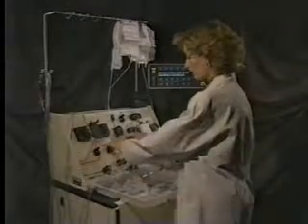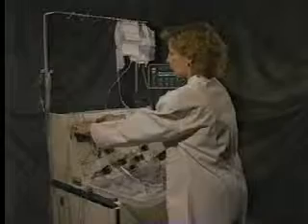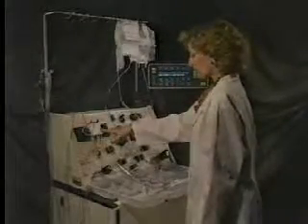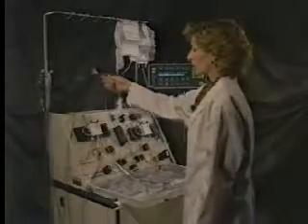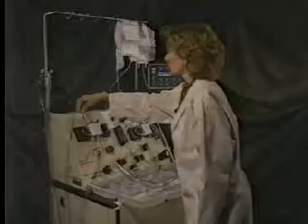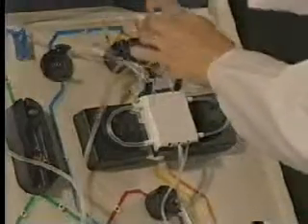Next, remove the access pump cartridge from the package and place it between the anticoagulant and the inlet pumps. Snap the cartridge into place. Again, the code label should be facing up. Remove the AC line from the package and place it over the top of the spectra system. Ensure that all tubing is clear of pumps and untangled.